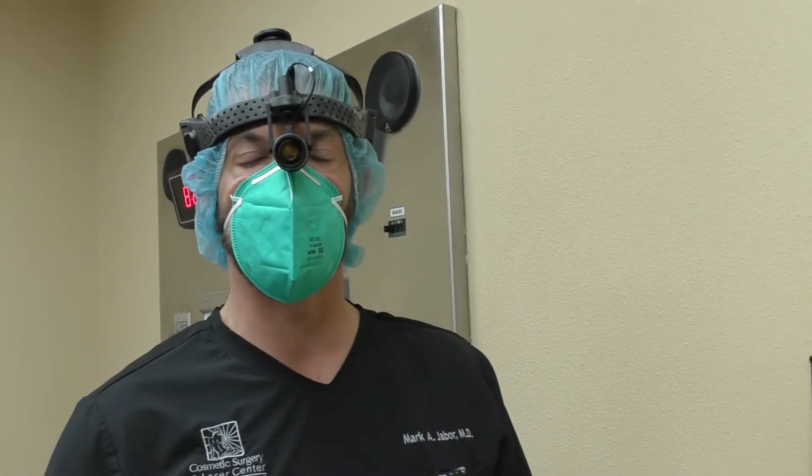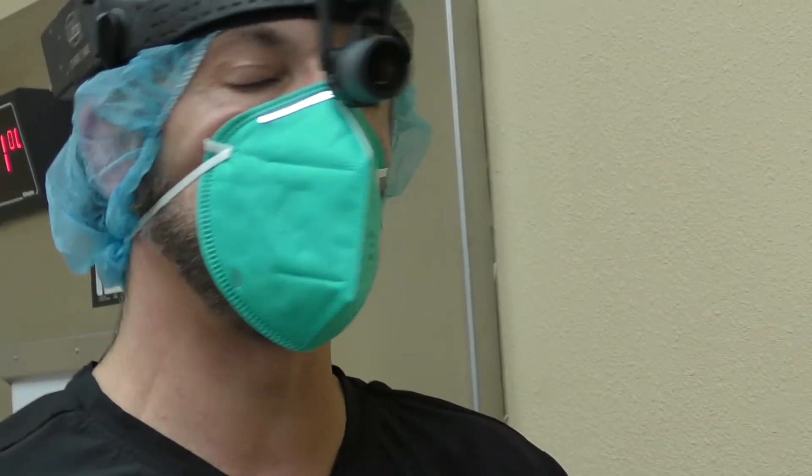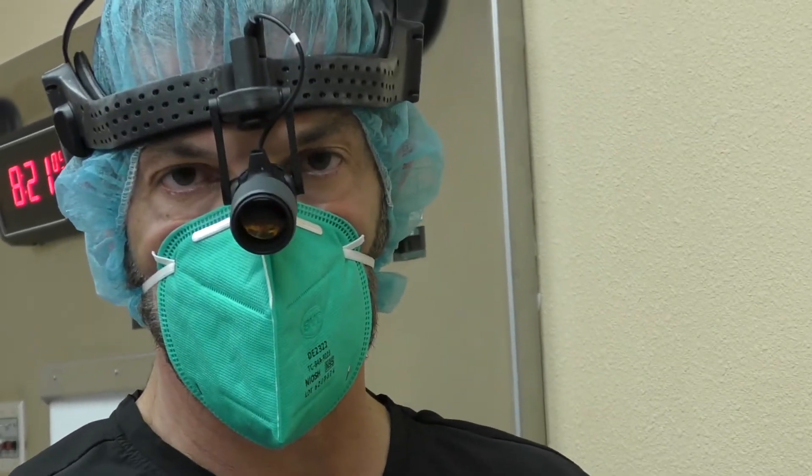Hi, I'm Dr. Mark Jaber of the Cosmetic Surgery and Laser Center of El Paso. Today we are going to be performing a lip augmentation utilizing a small solid soft silicone implant.